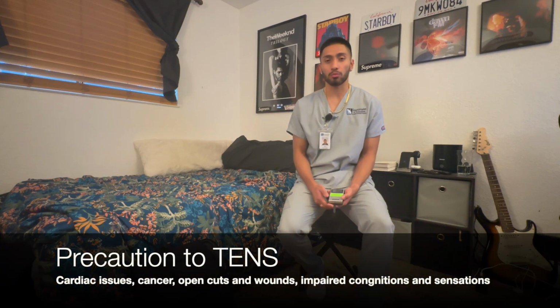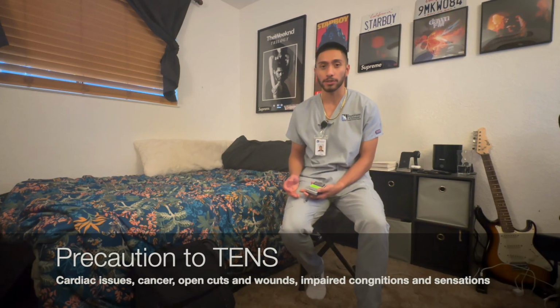Some of the precautions where we're going to need either a physical therapist or the physician to clear a patient of using a TENS device is if they have any cardiac issues, if they have any impaired cognition and impaired sensation, if they have cancer, and if they have any cuts or wounds in the area that we're treating. So with those mentioned precautions, we'll talk with a physician or physical therapist to see if a patient is good to go with TENS, and if they are, we'll go ahead and apply it.